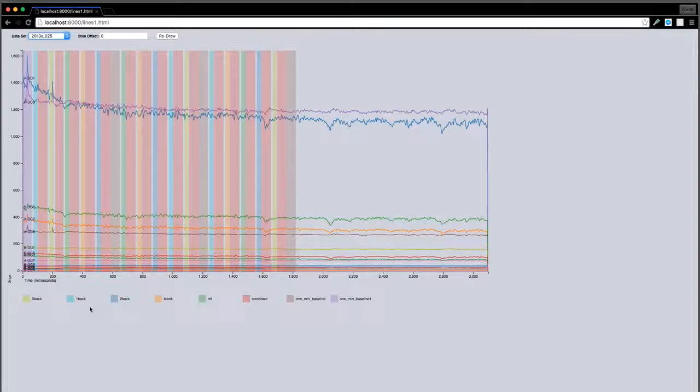So right here in this key, you can see there was one activity called 0 back, another called 1 back, 2 back, and then there were some different reference areas, cool down areas, and activities where they didn't have anything going on, a blank activity. And basically, these are different tasks that the test subjects are being asked to do as their brain is being scanned. And so the goal is that by looking at what happens to brain activity during specific types of time periods, you can start to do analysis to see how those different types of activities are affecting brain activity.